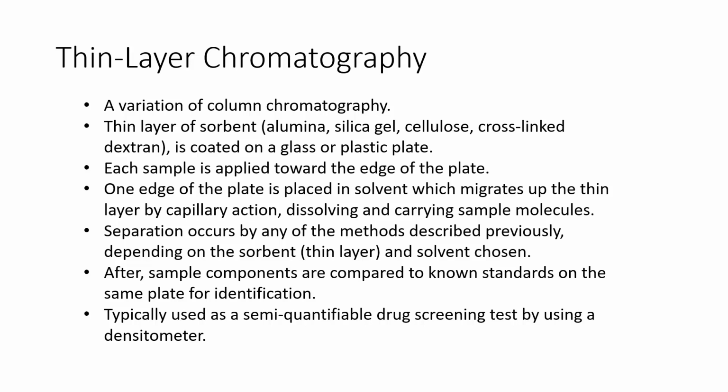The separation occurs by any of the methods described previously, depending on what thin layer you added to the glass and the solvent that you've chosen. After, the sample components are compared to known standards on the same plate for identification. It's typically used as a semi-quantifiable drug screen test using a densitometer.